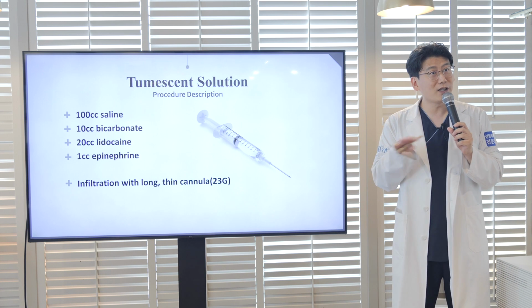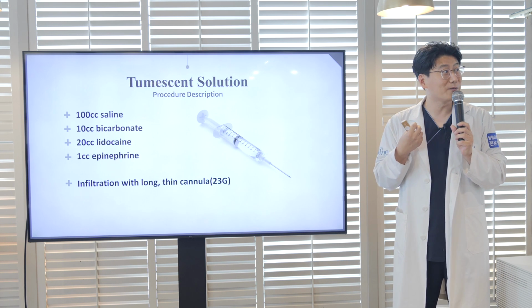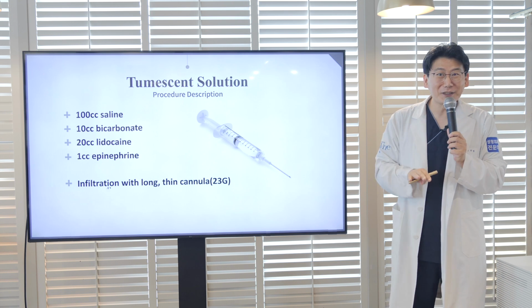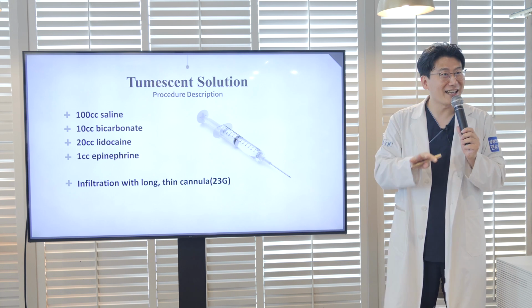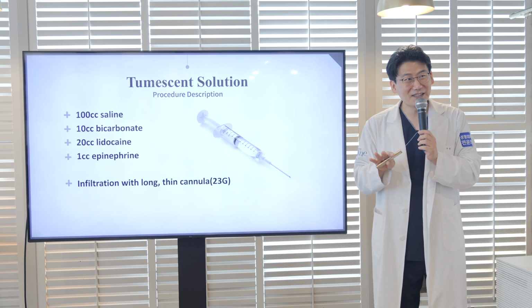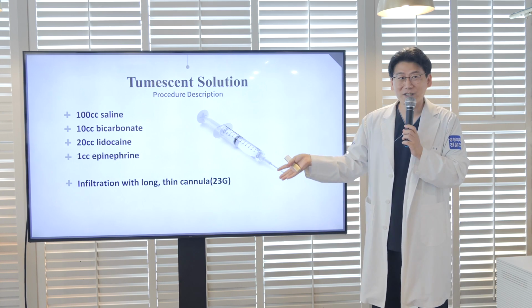Anyway, without IV sedation, the patient will feel pain. To reduce pain is very important, to persuade them to get the procedure again. So, please use this tumescent solution.